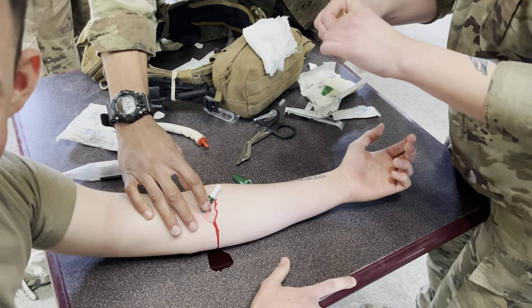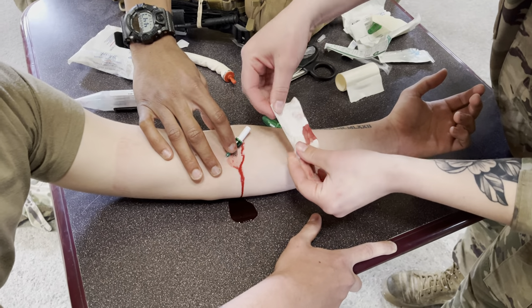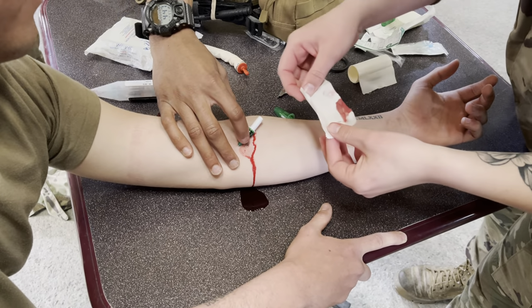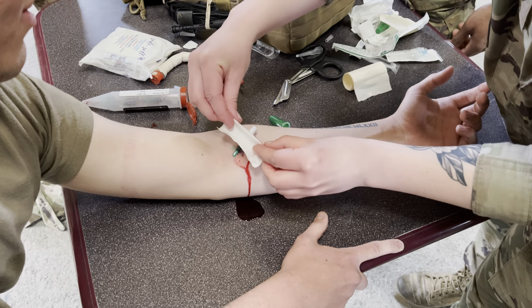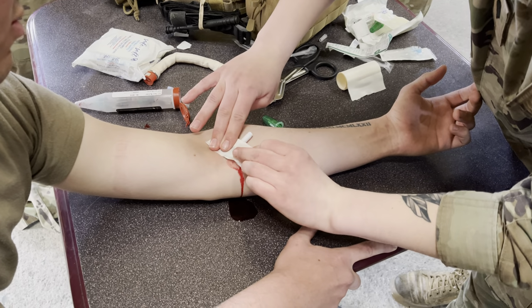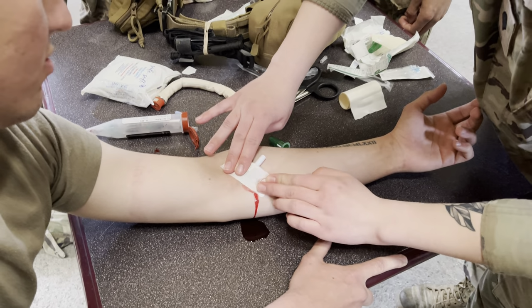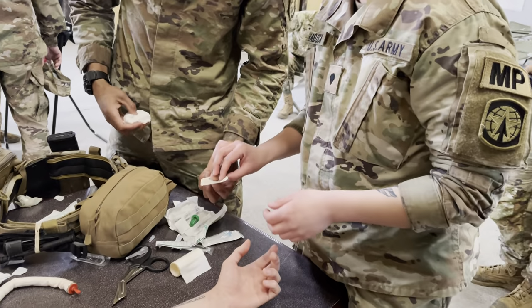An important thing too, when you have your tape prepped, just make sure that you always have a hand securing the catheter. Yeah, I'm getting up. Go ahead, throw this on.